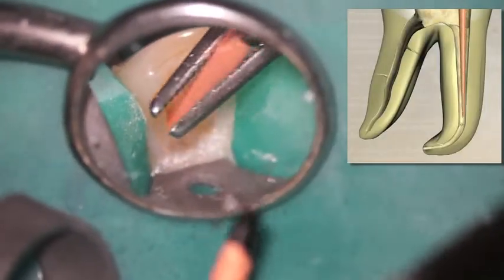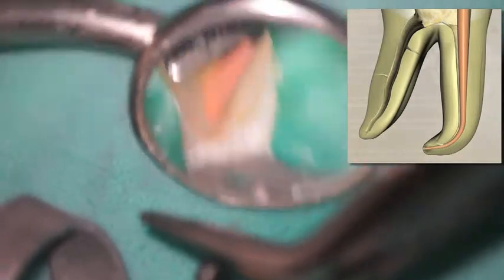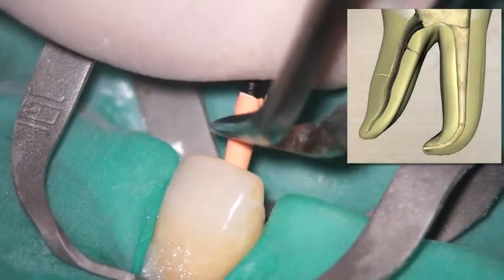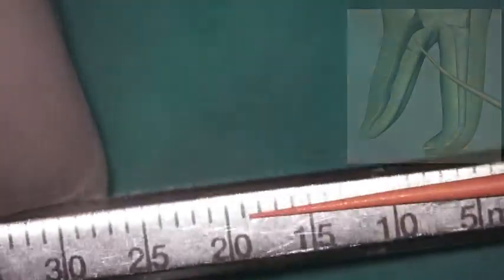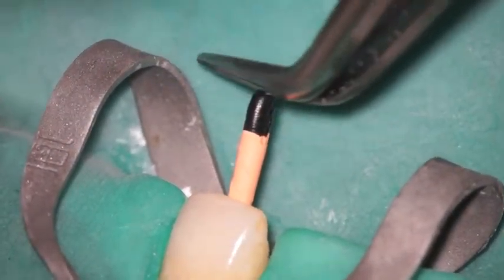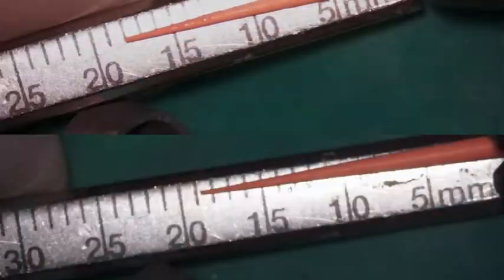Here we're fitting a cone, a gutta percha cone. Anybody that's done any significant amount of warm gutta percha realizes that based upon the size of the apical foramen and your various clinical skills based on experience, it's important to take that gutta percha cone and cut it back, creating what we refer to as apical tugback. That allows us to not only gauge the size of the apical foramen, but it also lets us determine how far back we want to cut our cone, because as we heat that gutta percha and condense it vertically, it's actually going to move closer to the apical foramen.